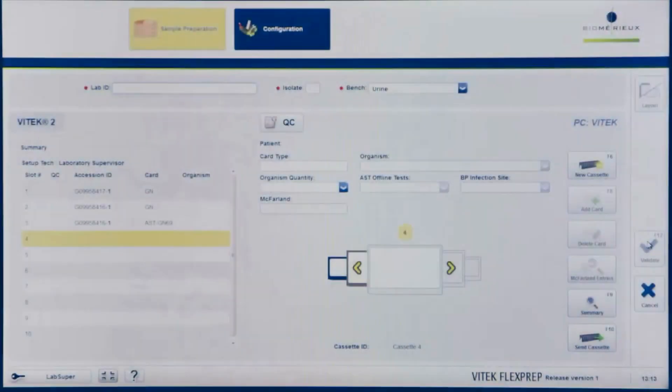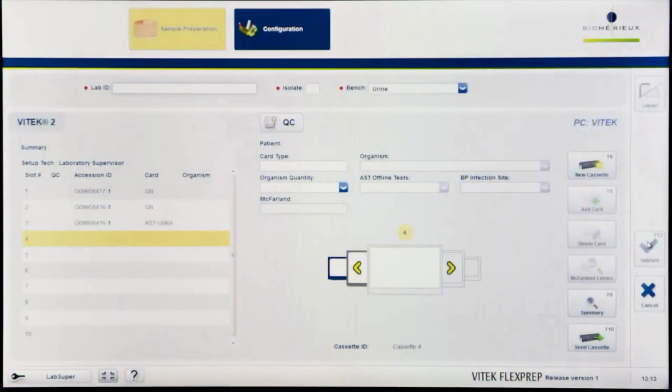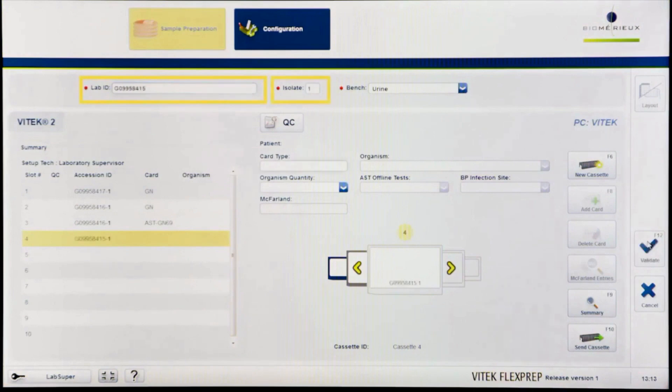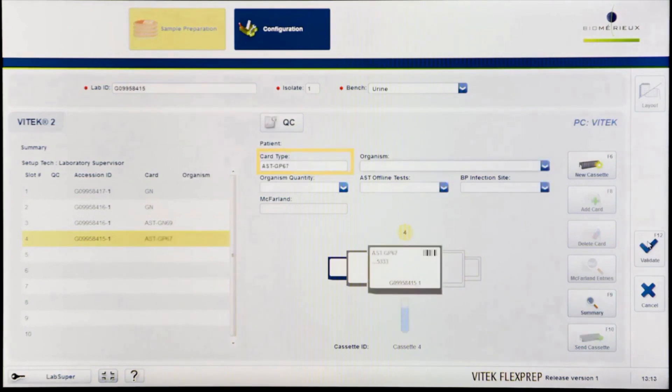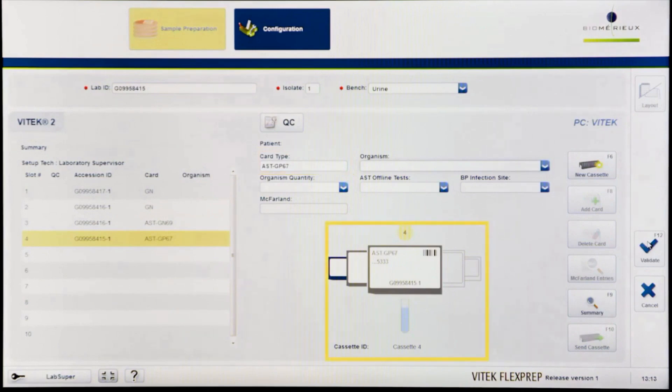When entering a single AST card, enter the lab ID and isolate number. On the cassette definition screen, enter the AST card barcode number either by scanning the barcode or by entering it manually. Once the card type is entered, a graphic of the isolate will appear displaying a card and a test tube.